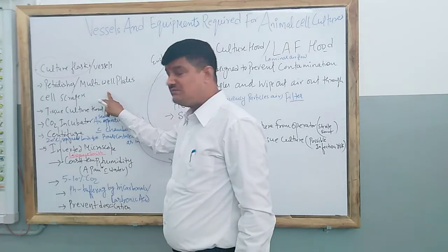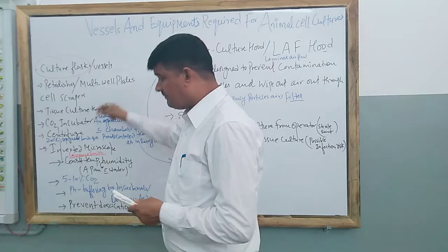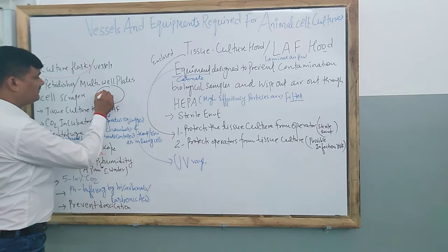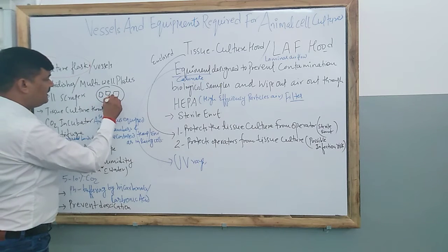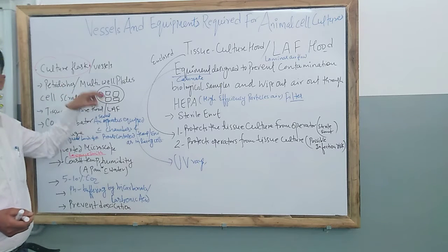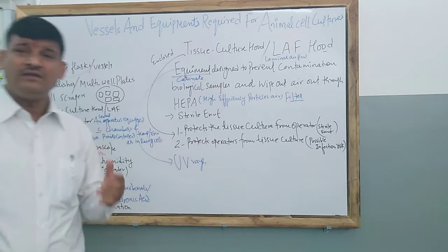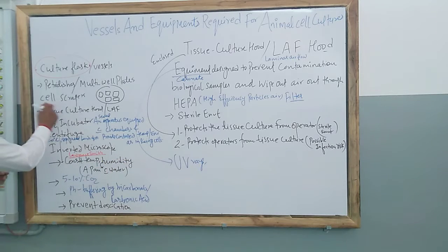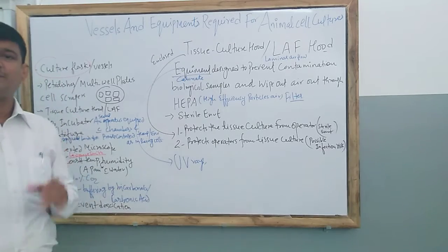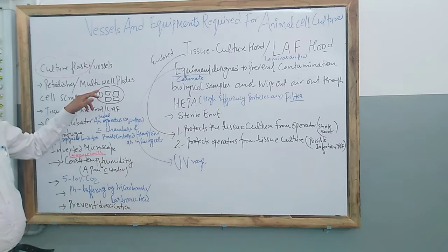Now the multi-well plates. Multi-well plates are made of glass or superior quality plastics, and there are a number of columns. Instead of one petri dish, there are blocks like this. Therefore, we call it the multi-well plate. These plates are used to keep the nutrient medium, and over that the culturing cells will be placed. Now, the cell scraper is used for picking up or putting the cells over the nutrient or culture medium.